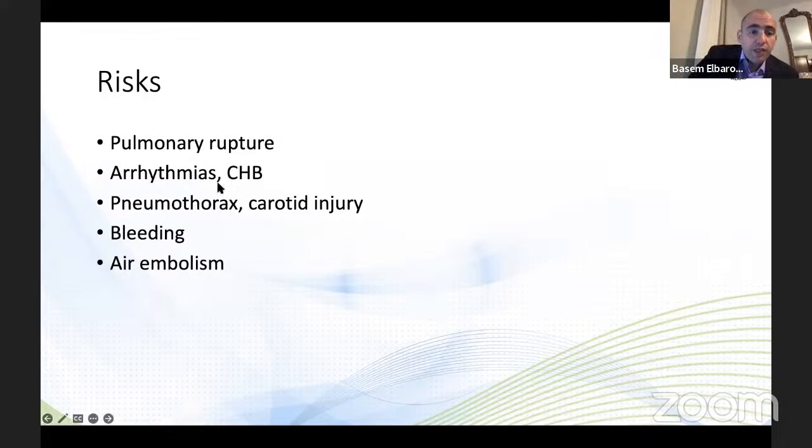The most serious complication that you can have is pulmonary arterial rupture. I've seen this once, and it was fatal. That happens when your Swan-Ganz is distal in the pulmonary artery and you inflate the balloon to wedge. So that's why I say it's important to make sure that you pull back the catheter before you inflate the balloon to wedge again. That keeps it safe.